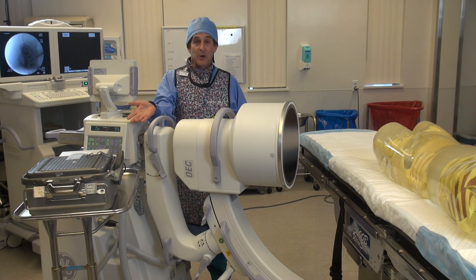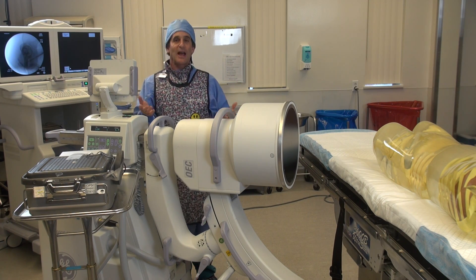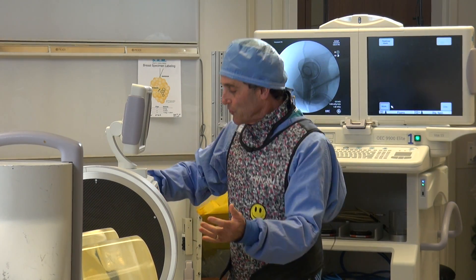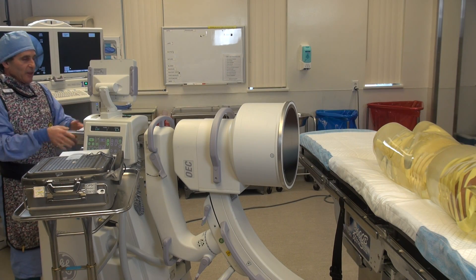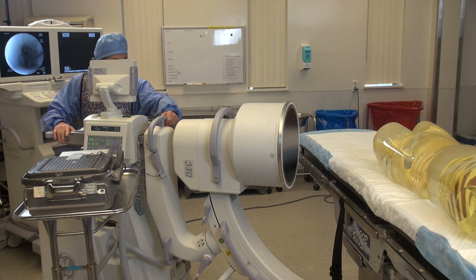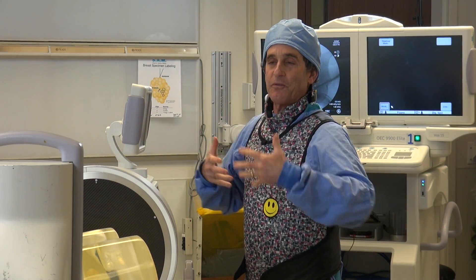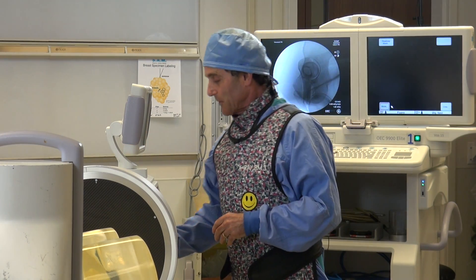As you're going to see, it's going to be zero. We picked four feet as the measurement distance because that's about where the tech would normally be. When you're making an exposure, you can't always be far back because you've got to move the C-arm — it's too hard from a distance. You usually end up grabbing onto the handles and maybe the back handle, moving it from closer in, which puts you in that four-foot zone.